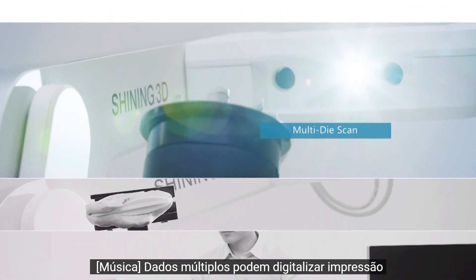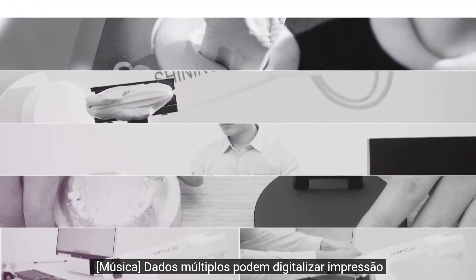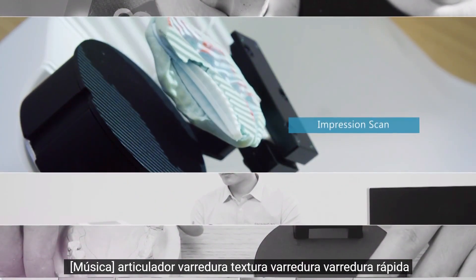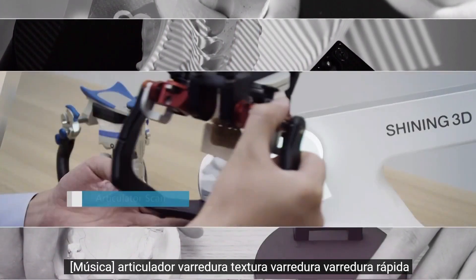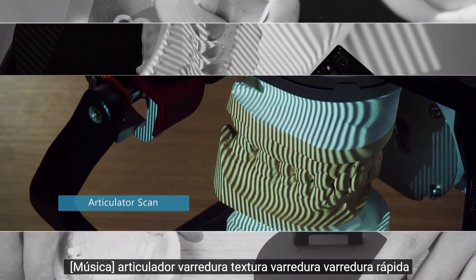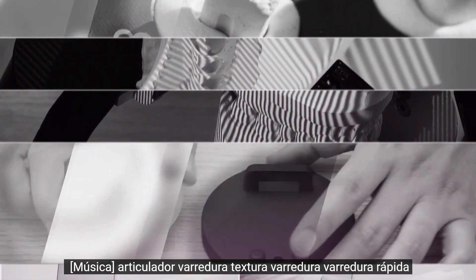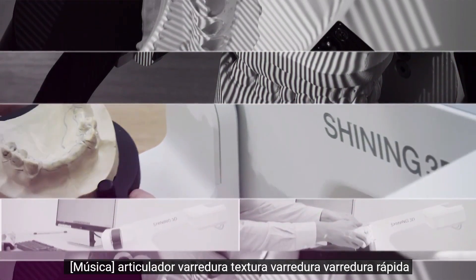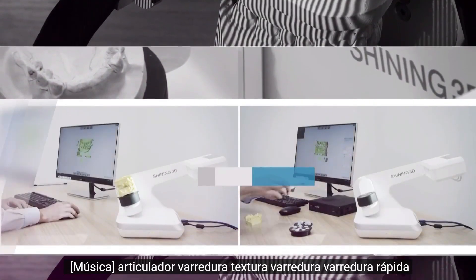Multi-die scan. Impression scan. Articulator scan. Texture scan. Fast scan.